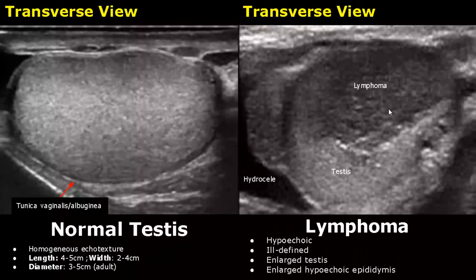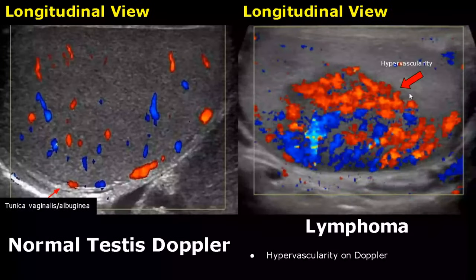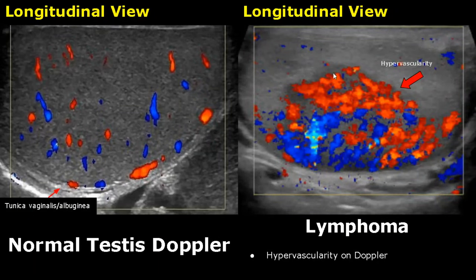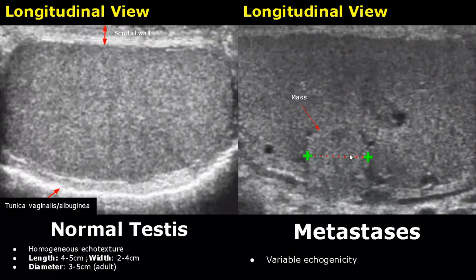Lymphoma is a testicular malignancy which is not very common and can be bilateral. The testis and epididymis will be enlarged. On color Doppler there will be hypervascularity inside the mass. Metastasis to the testis are very rare, have variable echogenicity, and can be bilateral.